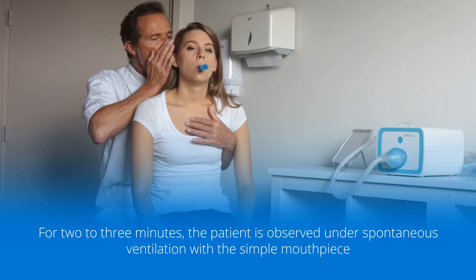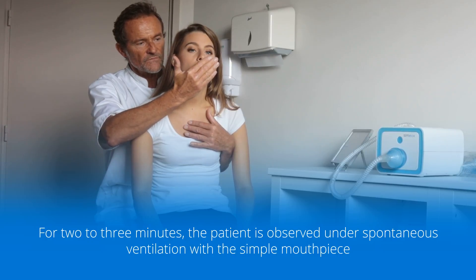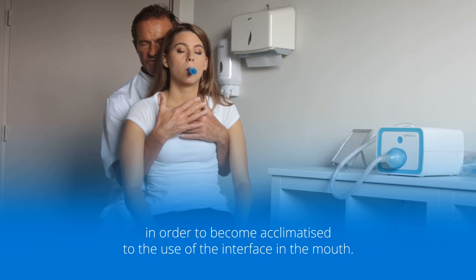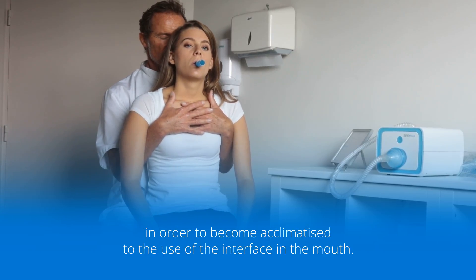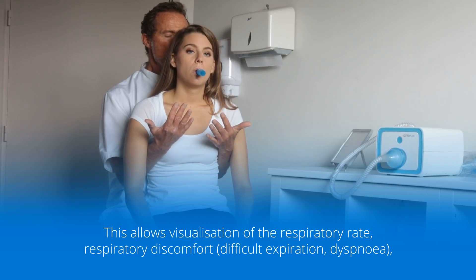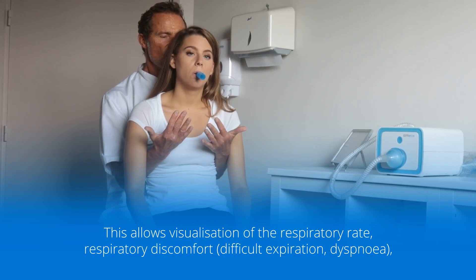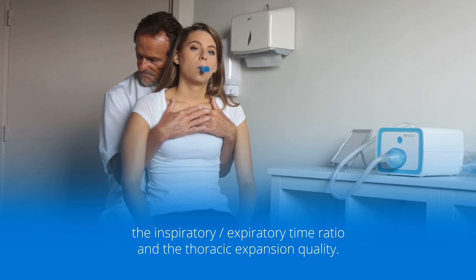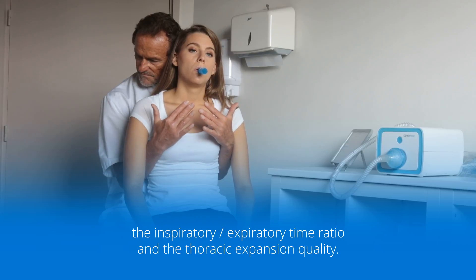For two to three minutes, the patient is observed under spontaneous ventilation with a simple mouthpiece in order to become acclimatised to the use of the interface in the mouth. This allows visualisation of the respiratory rate, respiratory discomfort, difficult expiration, dyspnea, the inspiratory-expiratory time ratio, and the thoracic expansion quality.